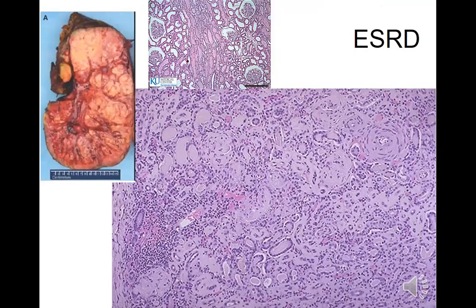End-stage renal disease, so now the kidney becomes completely dysfunctional. There's no parenchyma left to use. There's no more functional unit. The nephrons are not working. It's complete, massive. This is not just glomerulonephritis. This is end-stage renal disease.